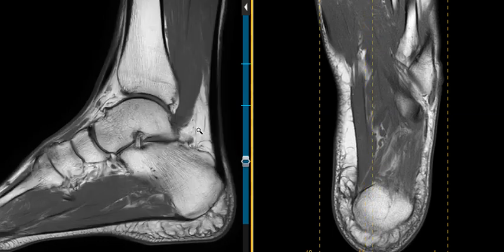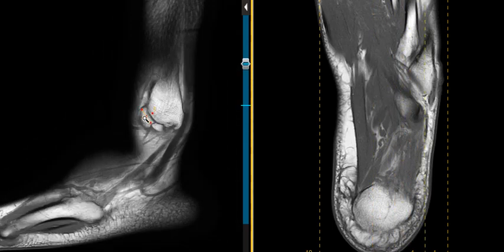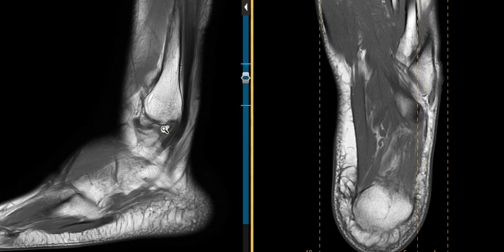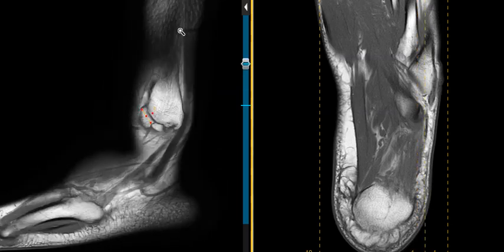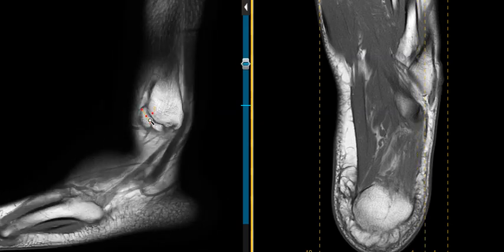The midline images all look very good, but if we roll laterally we see that there are at least three little bones that are not attached to the fibula. This is the fibula. At the very bottom we have some bone fragments. This looks like an old fibular fracture with at least three fracture fragments that are not fused.